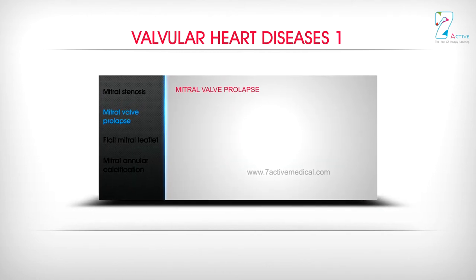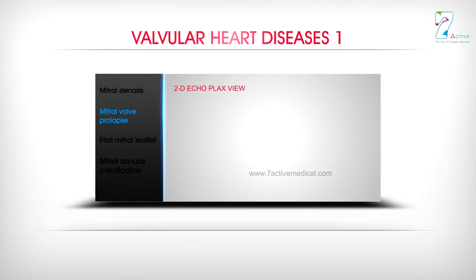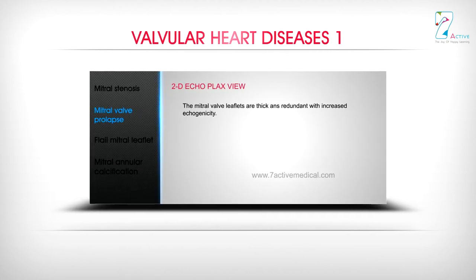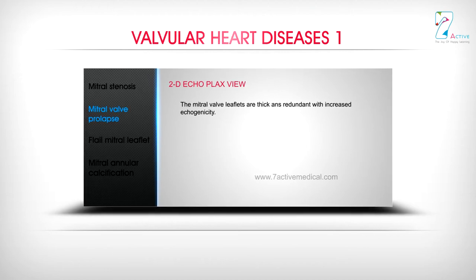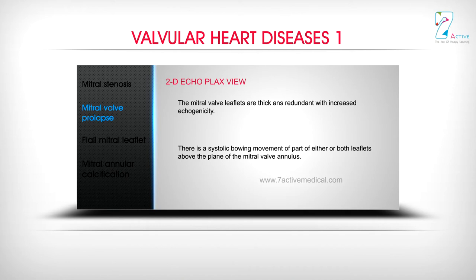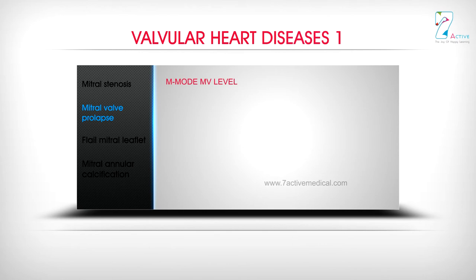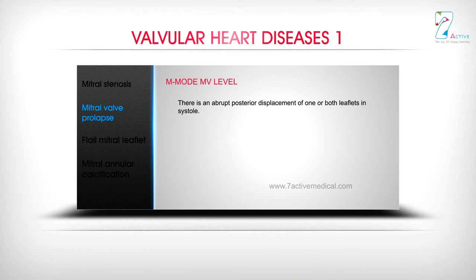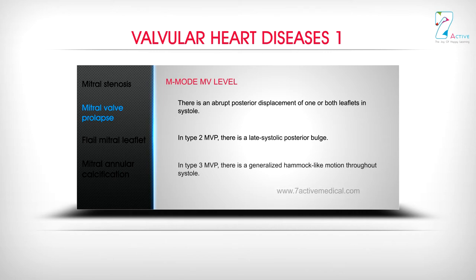Mitral Valve Prolapse — 2D Echo PLAX View. The mitral valve leaflets are thick and redundant with increased echogenicity. There is a systolic bowing movement of part of either or both leaflets above the plane of the mitral valve annulus. M Mode MV Level: There is an abrupt posterior displacement of one or both leaflets in systole. In type 2 MVP, there is a late systolic posterior bulge; in type 3 MVP, there is a generalized hammock-like motion throughout systole.